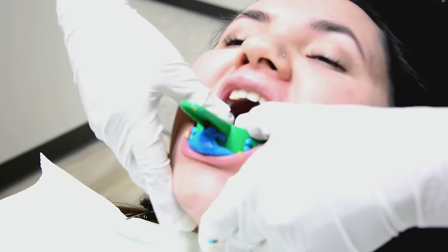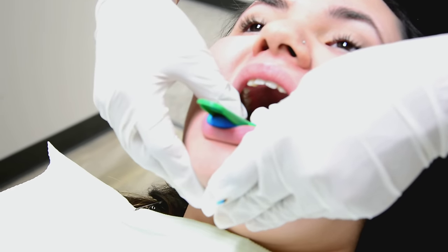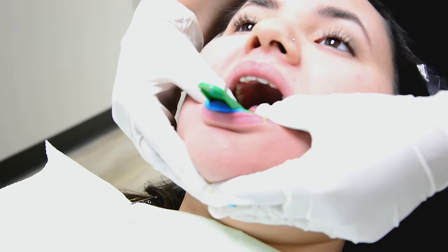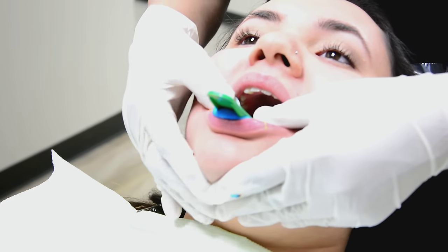Now she's going to place it into the patient's mouth. We seat it from the back to the front with light pressure, and it takes about four minutes to set. So we wait for four minutes.